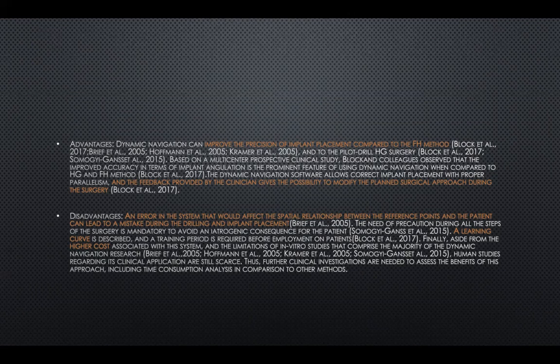You will monitor your drilling as it goes into the bone. This type of luxury, you don't have when you're doing your surgery freehand or when you're using a static guide. You cannot monitor the actual angulation and depth of your drill relative to the bone.